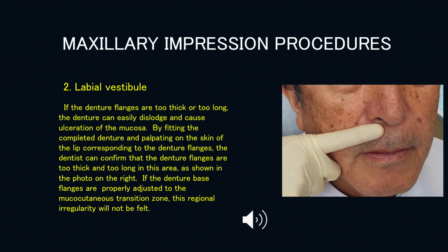Two. Labial vestibule. If the denture flanges are too thick or too long, the denture can easily dislodge and cause ulceration of the mucosa.